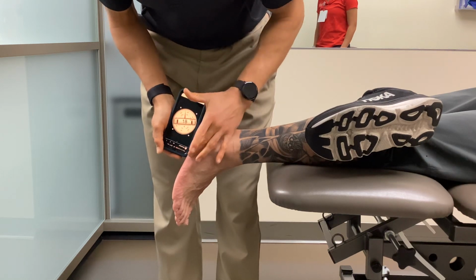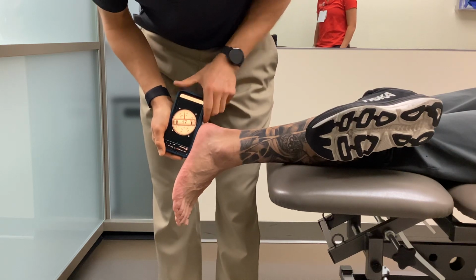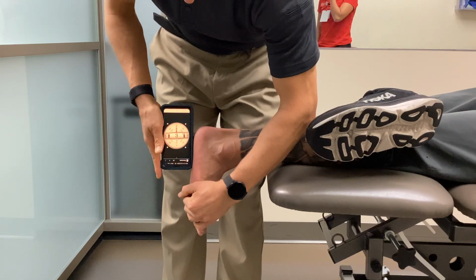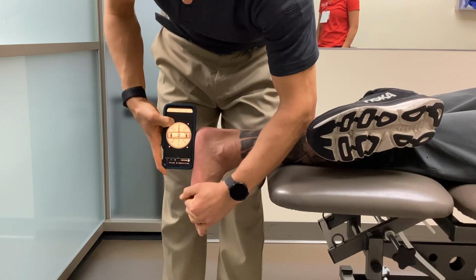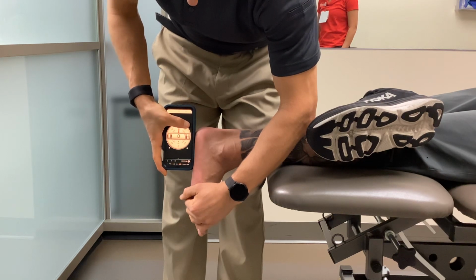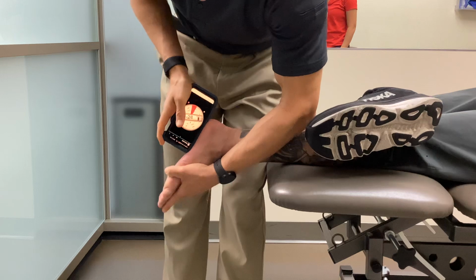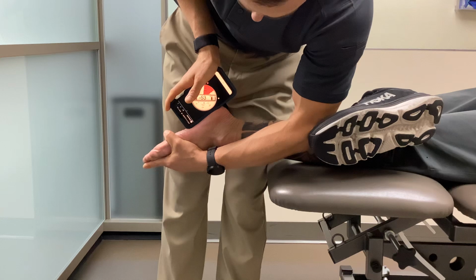So then the corner of my phone is going to go right at the 5th metatarsal. And then I usually will bring the patient into an absolute vertical position, such that my phone reads close to 0. And then from there, I will click the small button, which will give me an arc of motion. And if we want to just look at it passive, I click it and then just passively move the ankle into full plantar flexion with a plantar flexion of 53 degrees.